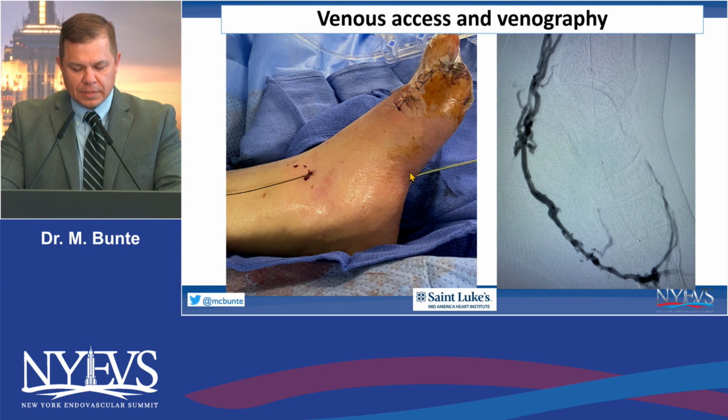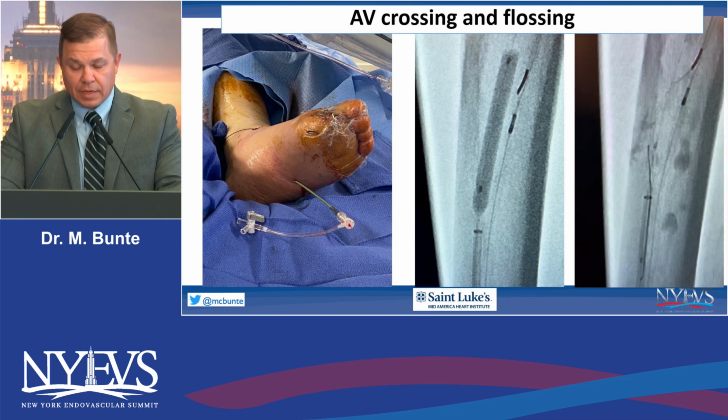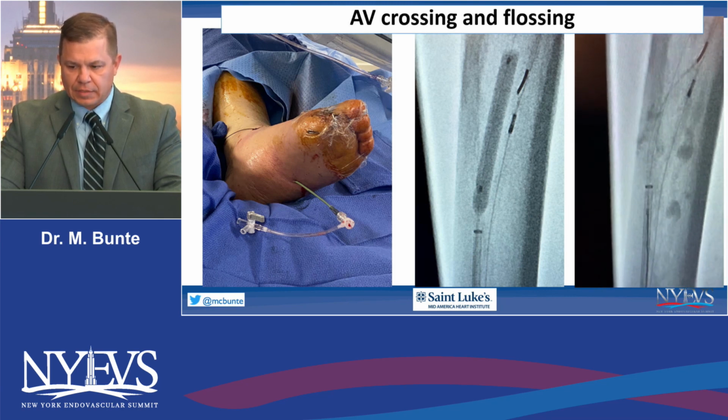So it does take some time to kind of get used to the venous access in the foot. It's about 2 centimeters deep in some patients. So you want to stick it once, and there's some tips and tricks to ensure success. Then after your venous access is in, usually antegrade access is no problem.